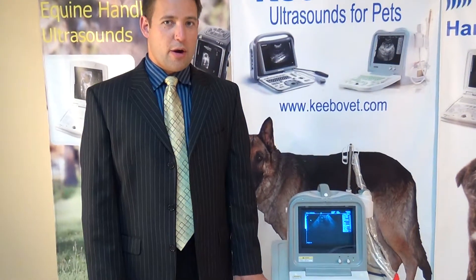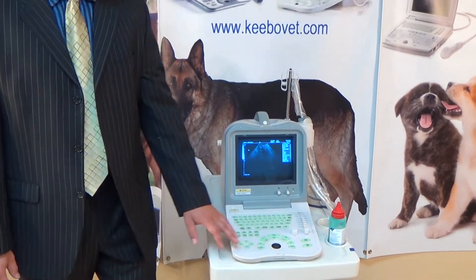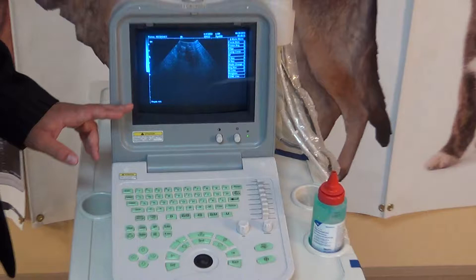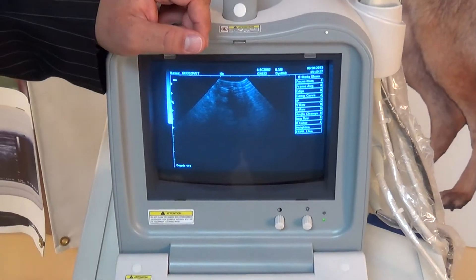Hello again. My name's Theo for QMN. We're going to be going over part two of three for our model KX 2600KV ultrasound machine, covering the center area of the computer. Just before we get started, a reminder: this is a CRT monitor, so the flashing that you're seeing is only seen when you video record it — in person, that will not be there.